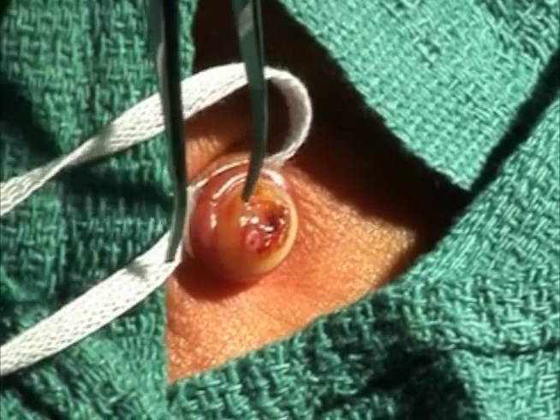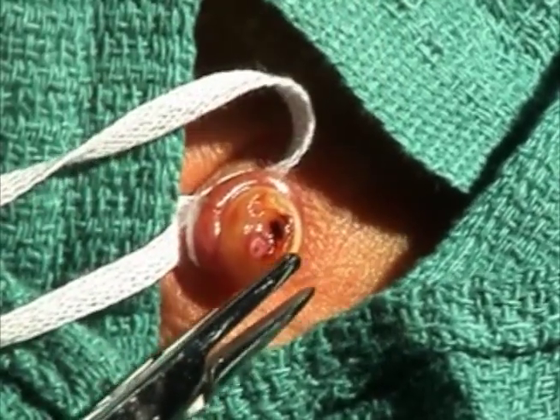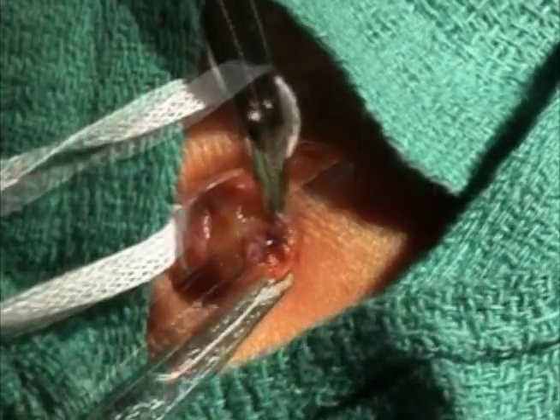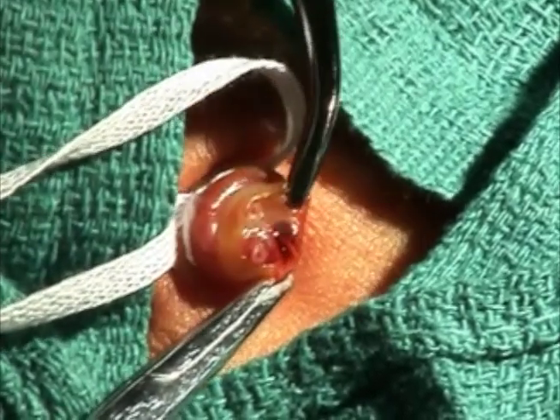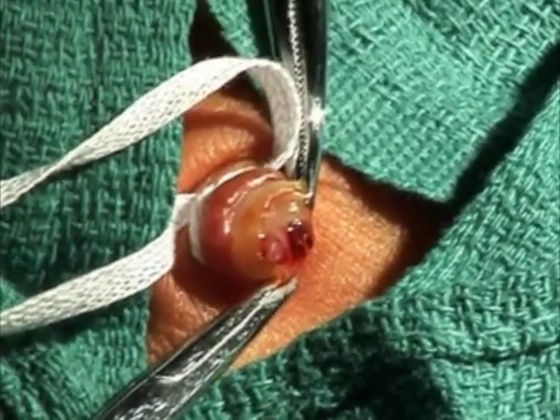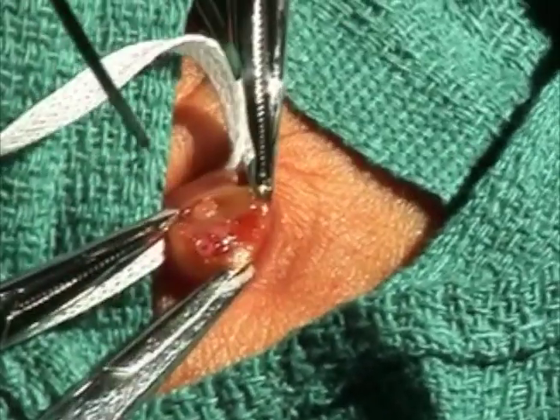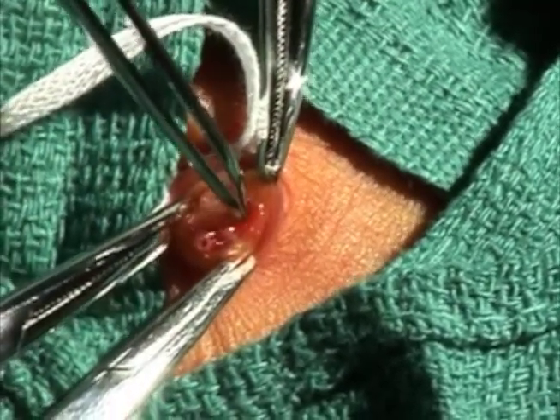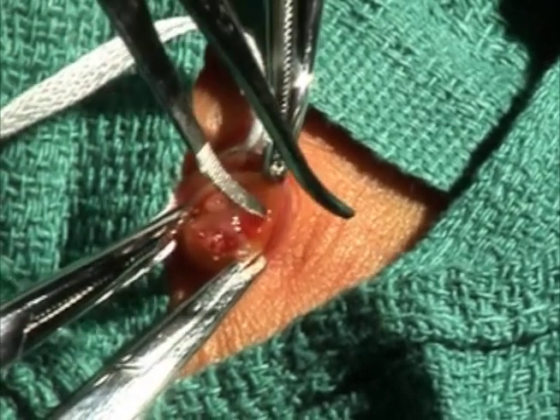The assistant should use the toothed mosquito hemostat to grab the side of the cord near the artery to be cannulated, and should avoid grabbing the artery. Clamp a curved hemostat to the opposite side of the cord. The assistant should apply traction to these hemostats in opposite directions to stabilize the cord. Using your non-dominant hand, place the closed or pinched tip of the curved iris forceps into the lumen of the artery to a depth of approximately 0.5 centimeters.